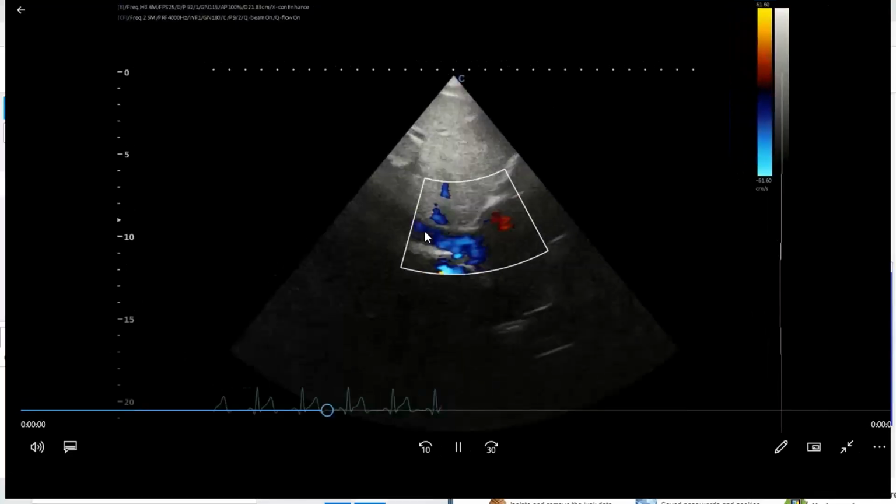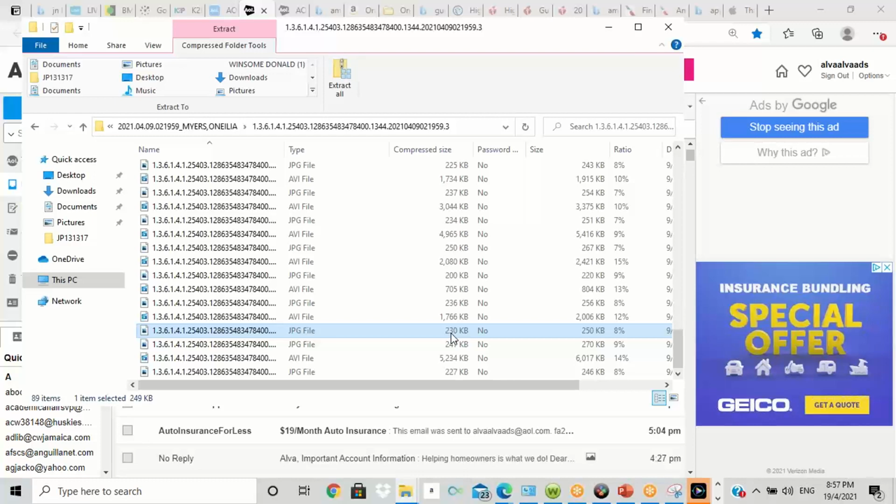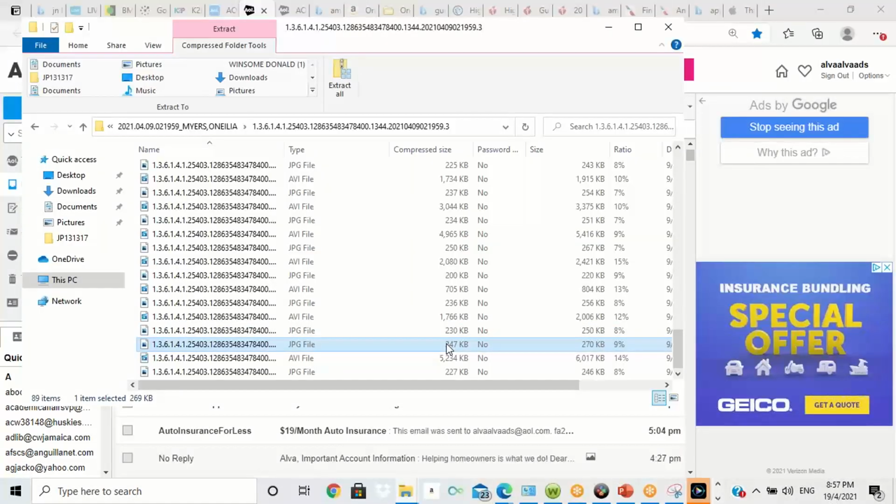So this is your inferior vena cava running through the liver. The hepatic vein is someplace right there. So this is the hepatic vein, and you want to Doppler that. It's exceedingly important to Doppler your hepatic vein, because it gives you a lot of information, and it can give you hemodynamic information as well. You want to do pulse wave Doppler of the hepatic vein.